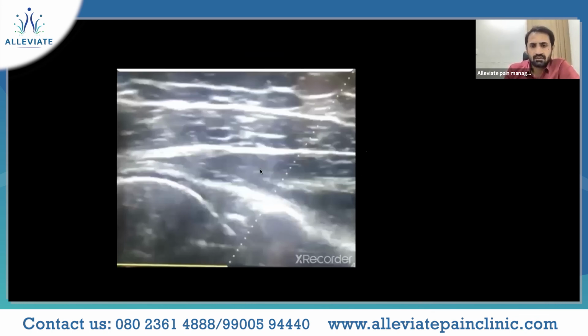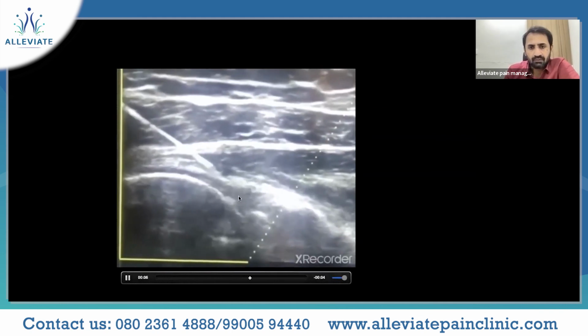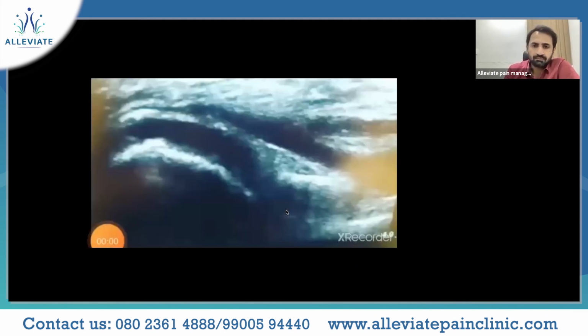This is a case of frozen shoulder, posterior joint line. You can see the labrum. You can see in-plane needling. The labrum in this case.